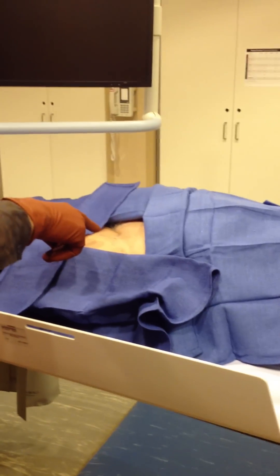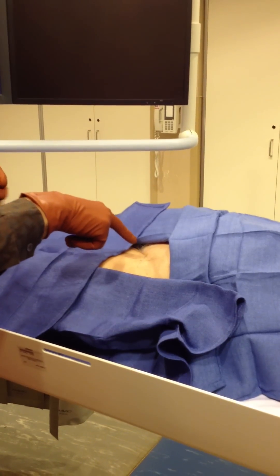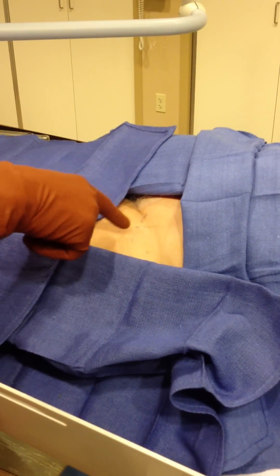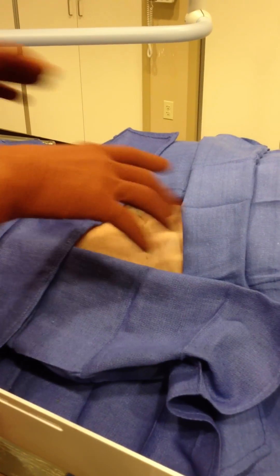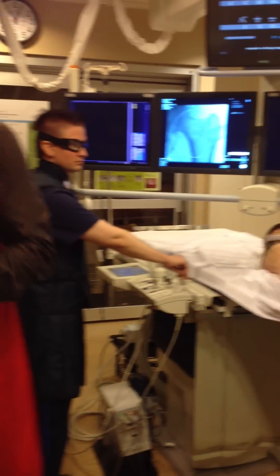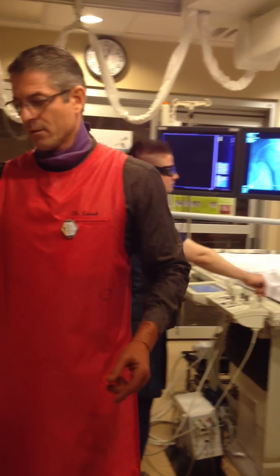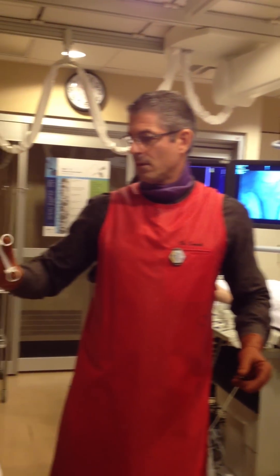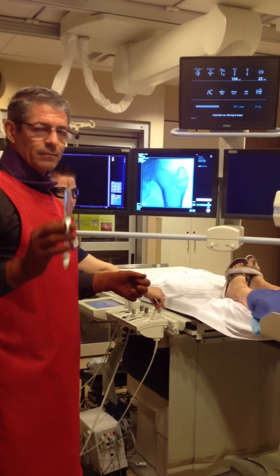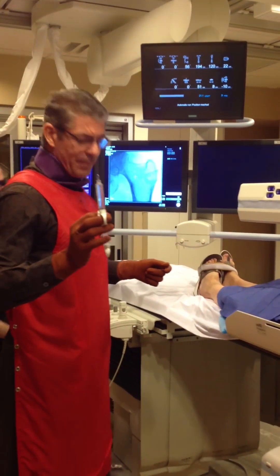So here's the patient setup — you usually get the patient to mark the skin about where they think I want to go in based on what I've taught them in the past. That saves some time. It also lets us clean the area. We've got her all draped and ready to go. So now let's bring the fluoro down. Start with a little lidocaine — 1% lidocaine premixed with epinephrine.